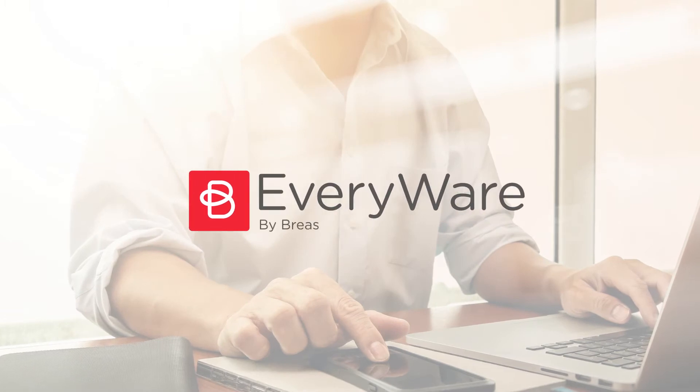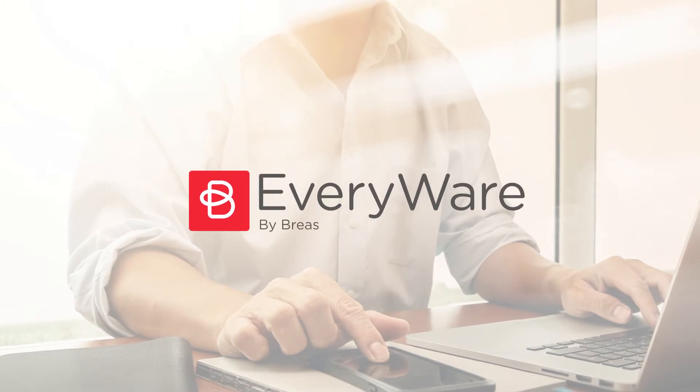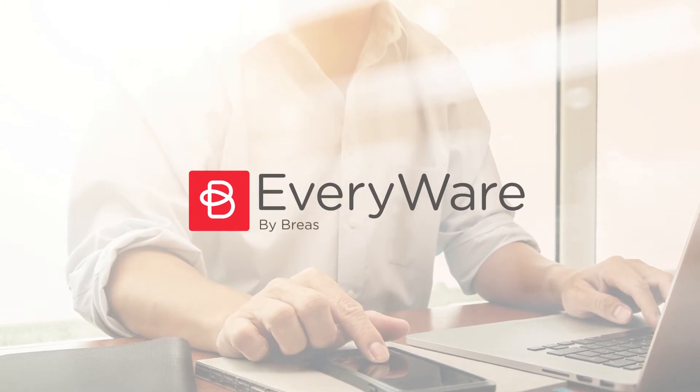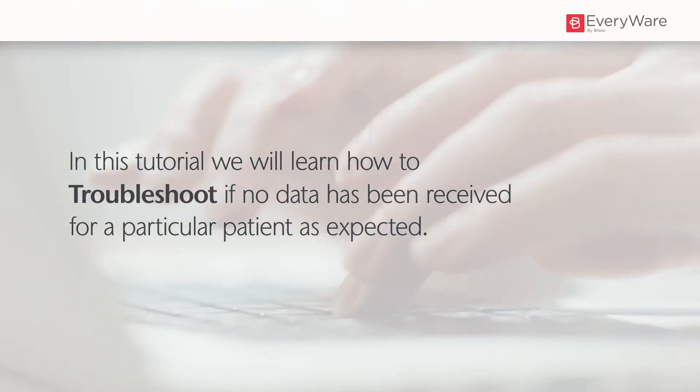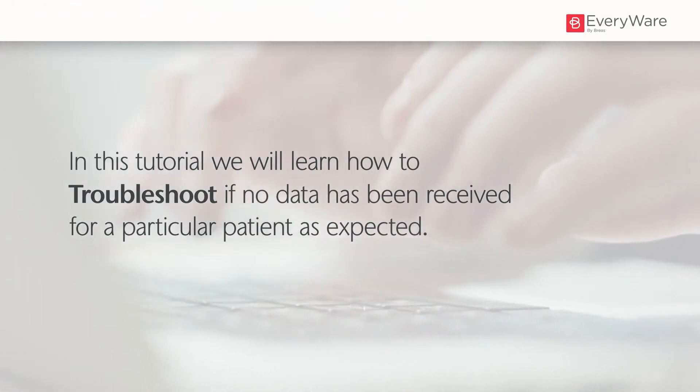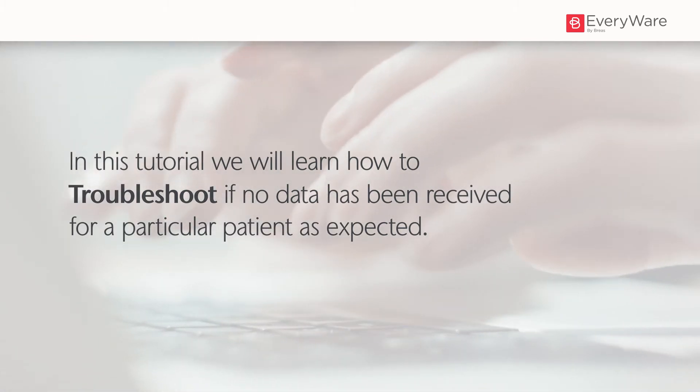Welcome to the Breas tutorial series for EveryWare. In this tutorial we will learn how to troubleshoot if no data has been received for a particular patient as expected.